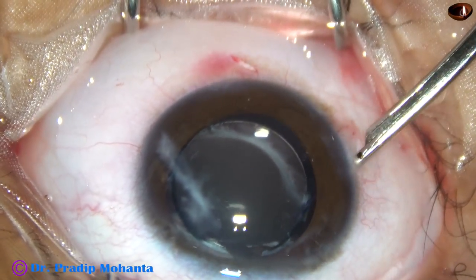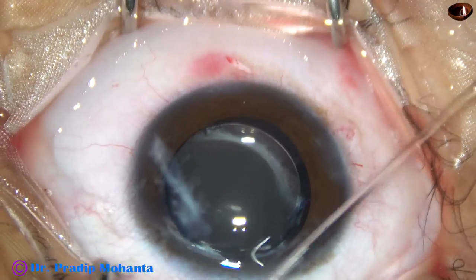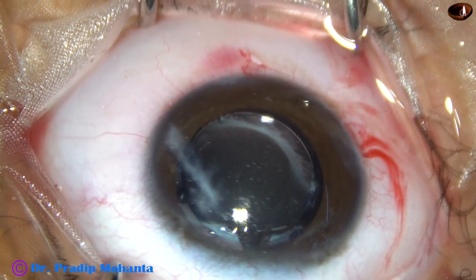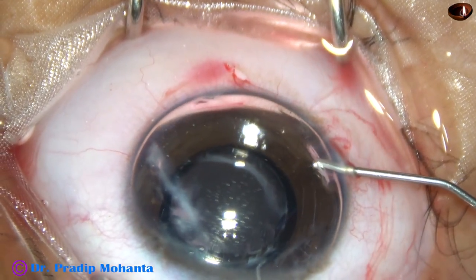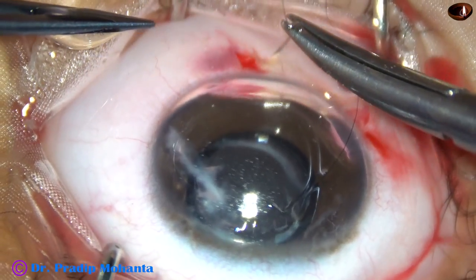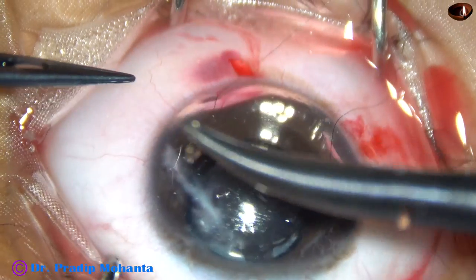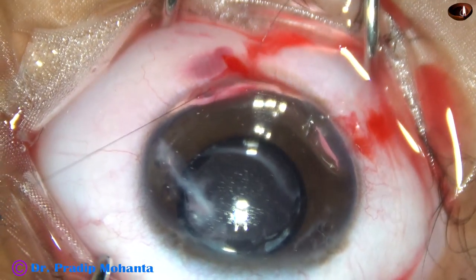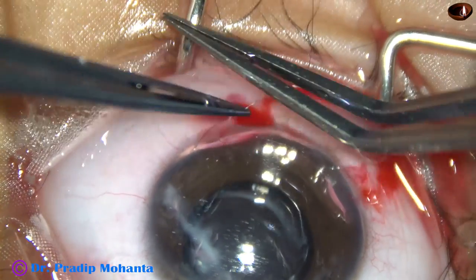Here I try to form the anterior chamber with the Simcoe cannula. The 9 o'clock incision is a triplanar incision and I am sure this will be a self-sealing wound. But the anterior chamber maintainer has stressed the wound and there is some fish-mouthing — it is not getting closed by hydration. So I am applying a suture. This is just a releasable suture; it is going to be here for about 3 to 4 days, and after that I will just pull it out.